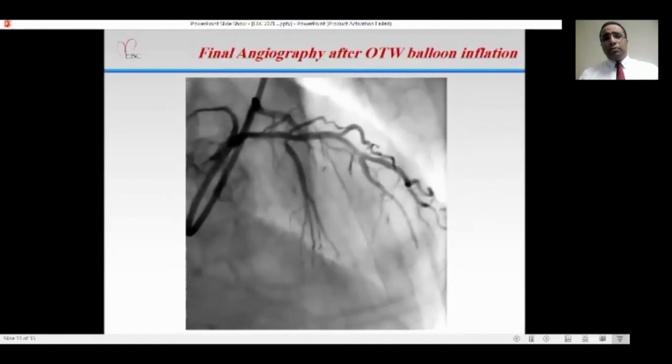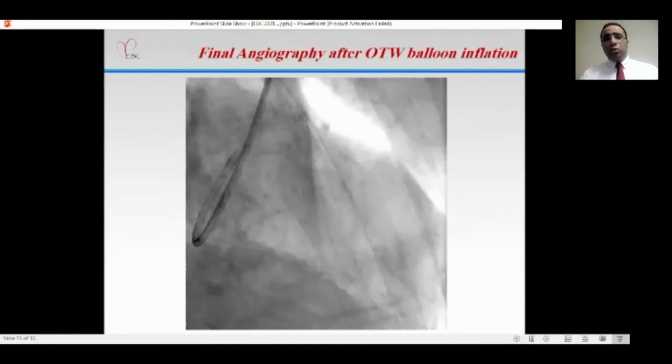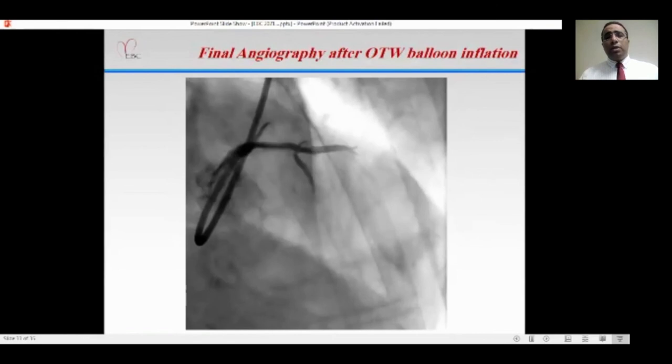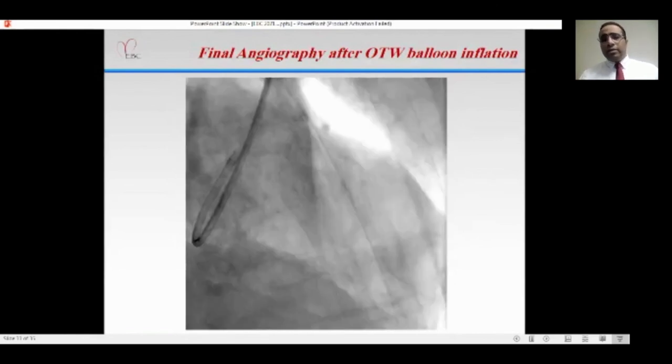Here also, good TIMI flow. I decided, after this good angiographic result, to stop at this level, put the patient on dual antiplatelets and maximum medical treatment, and stop at this level.